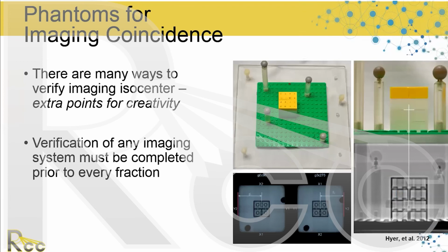There are lots of different ways to do these tools or these tests, and I think you get extra points for creativity. This was done at University of Iowa, where they built a tool with Legos. Legos are famous because of their precision. They spend a lot of money and time on quality control so that the pieces always fit together perfectly. Lego doesn't have a patent, so maybe you played with Mega Blocks or something else. Those don't always fit together quite as nicely. The thing that sets Lego apart is their quality control.